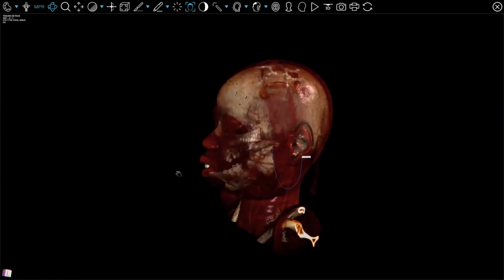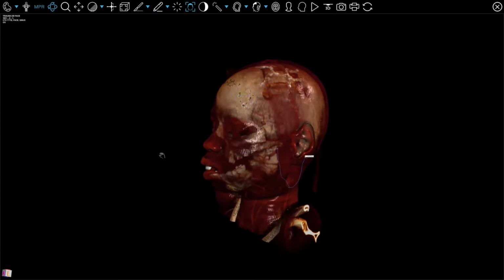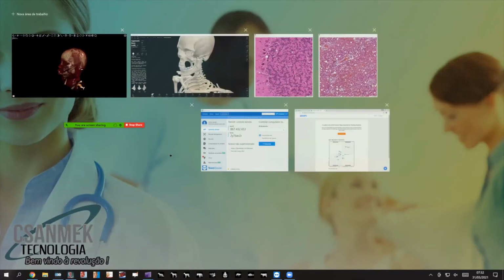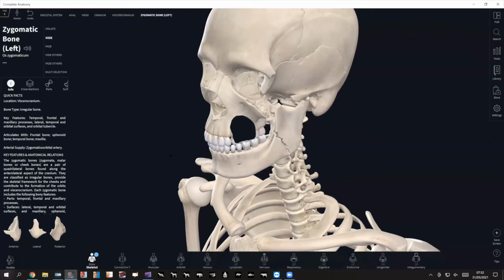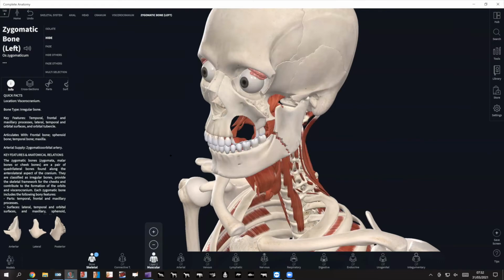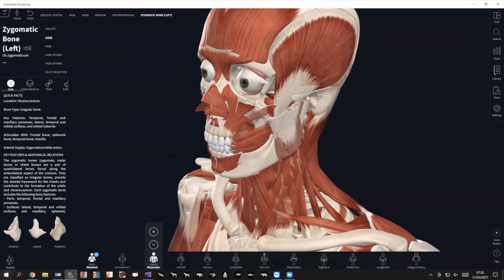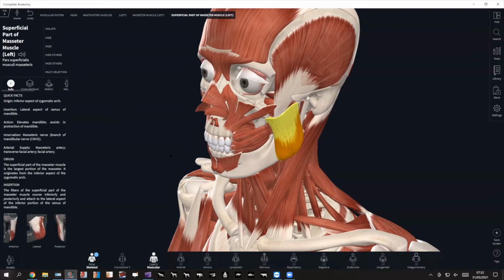What is interesting here, we are randomly doing correlations, but you guys can prepare the class you want in the platform. So you can basically plan the content you want to show and really approach the topic you guys want to do. And this is really appreciated in the universities we work with here. So now he's reviewing the body with the other structures.